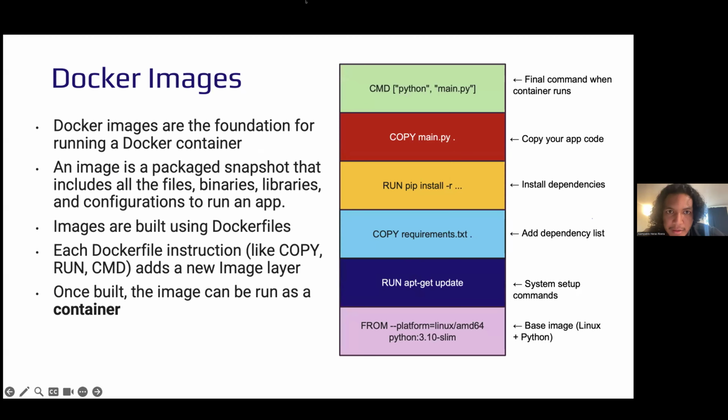It says, do you store the checkpoints also in the containers? Yes. So I'll go into more explicit detail about what is included in the container moving forward. But yes, the checkpoints are important to run your models, and they'll be copied in this step when you copy your app code. So here I copied only the main.py, but in this step you'll actually be copying your entire code base and everything that you want to be included in the container. Great question.